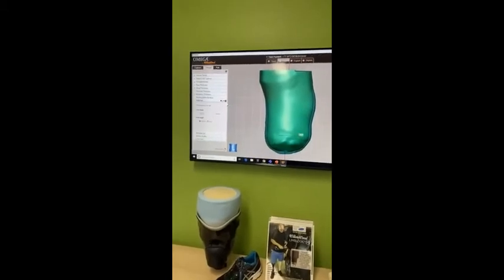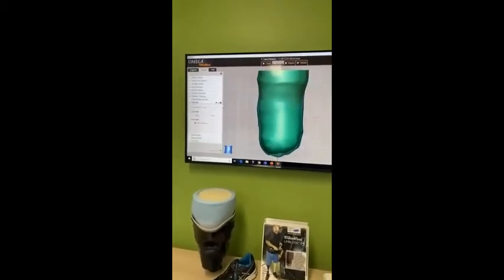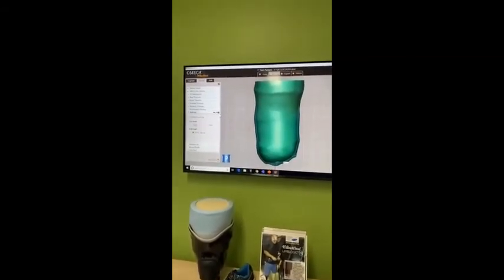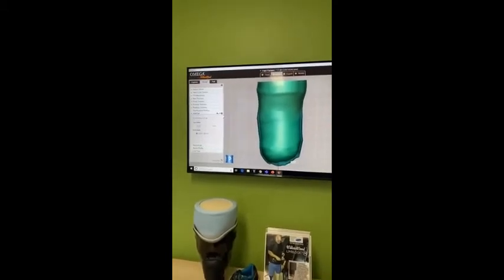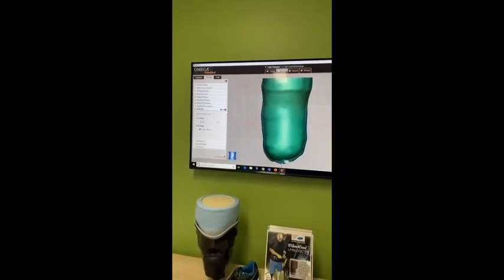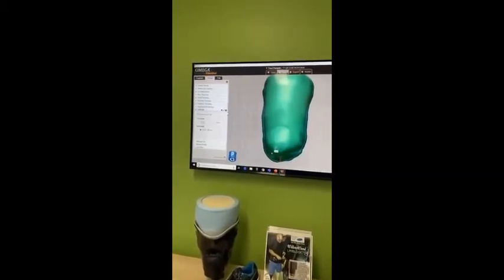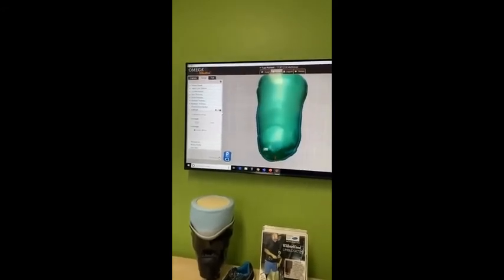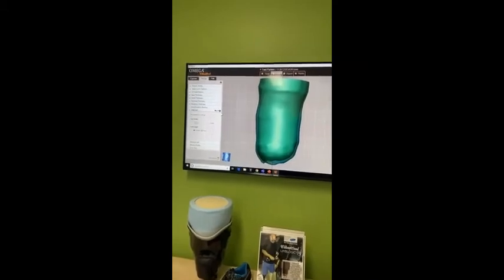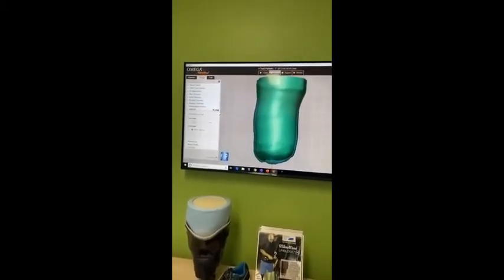Just make it more uniform. Yeah, if you're not happy with anything, we can remove it.